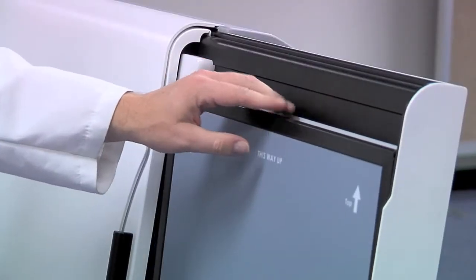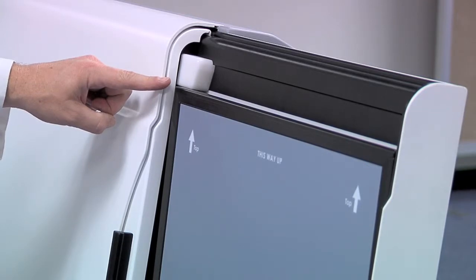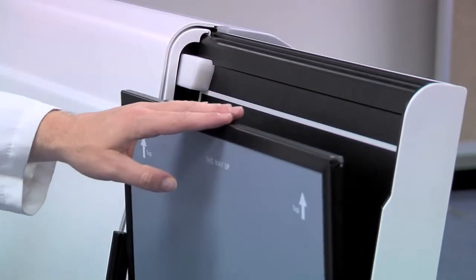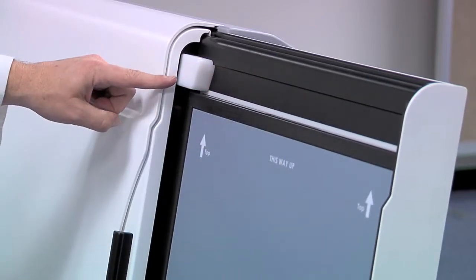If the cassette comes in contact with the loading block, it has been loaded incorrectly and must be reloaded. Slowly pull the top of the cassette towards the front of the CR until the cassette moves into place.